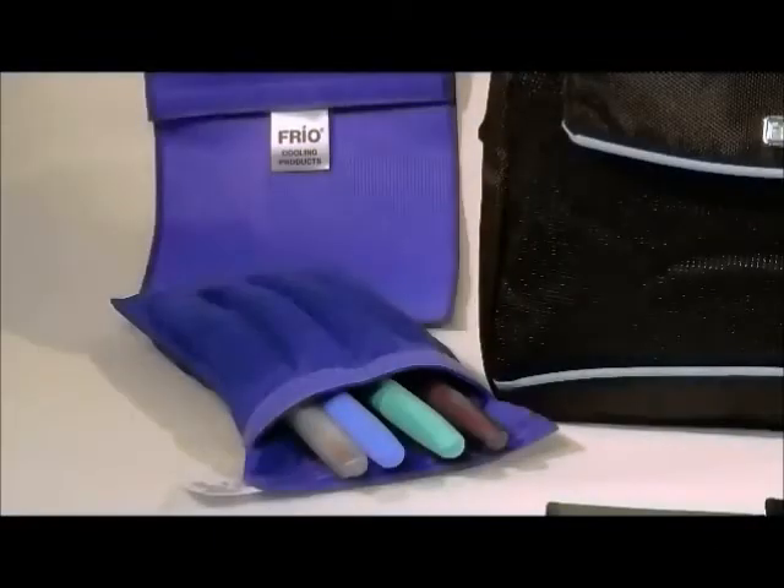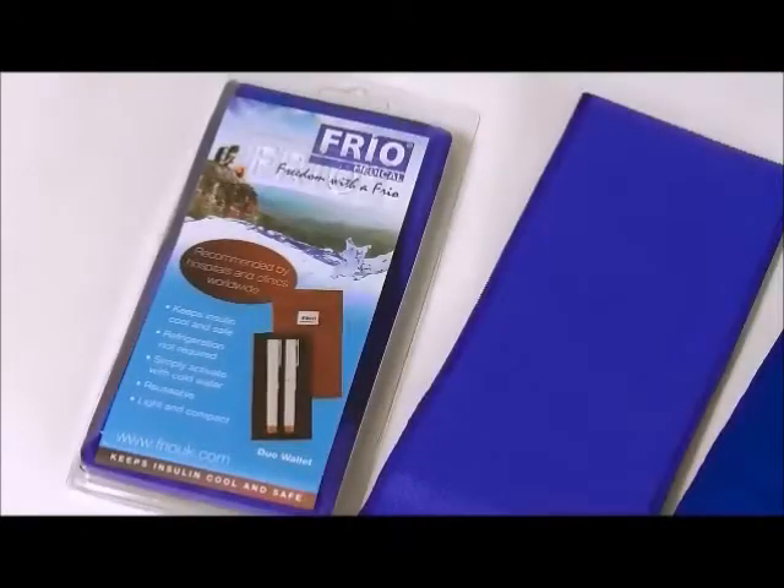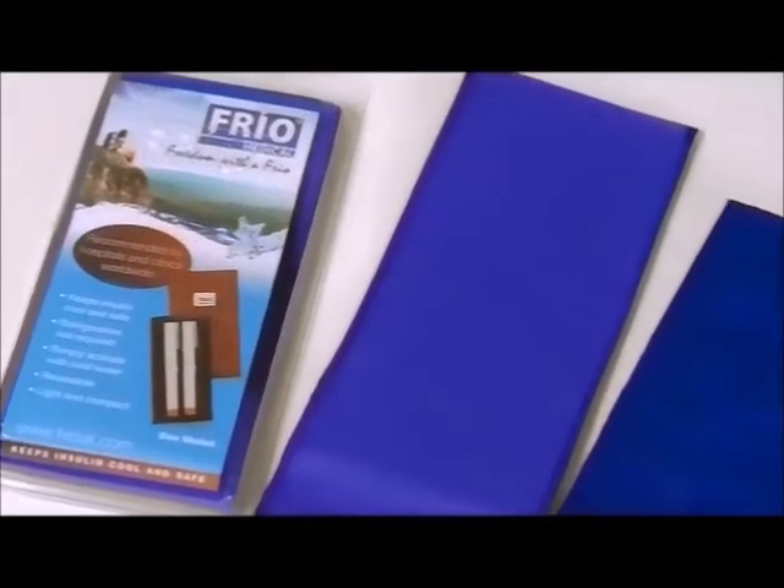This is the Frio Insulin and Medication Cooling Wallet. You're about to watch a simple demonstration of its activation and use.